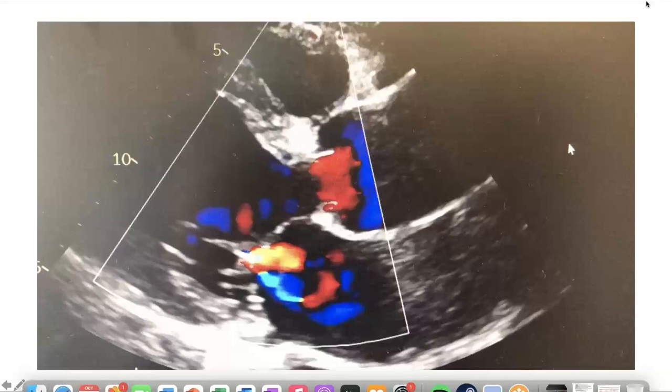And we know when the ventricle dilates, as you nicely showed with the pressure volume loops, it undergoes this eccentric dilatation and takes on a more circular shape at the apex.